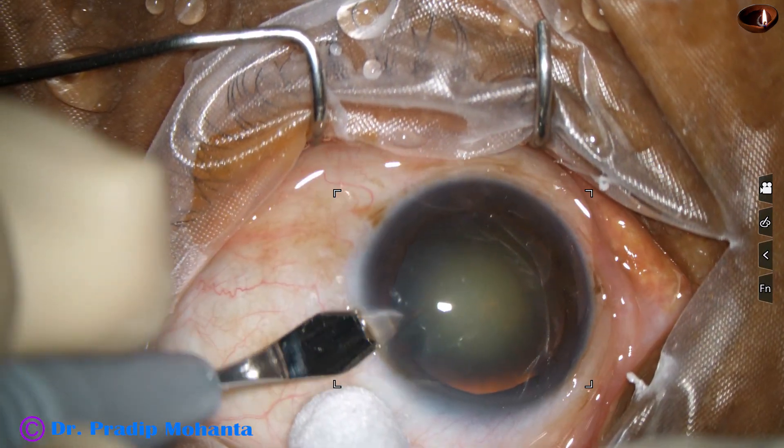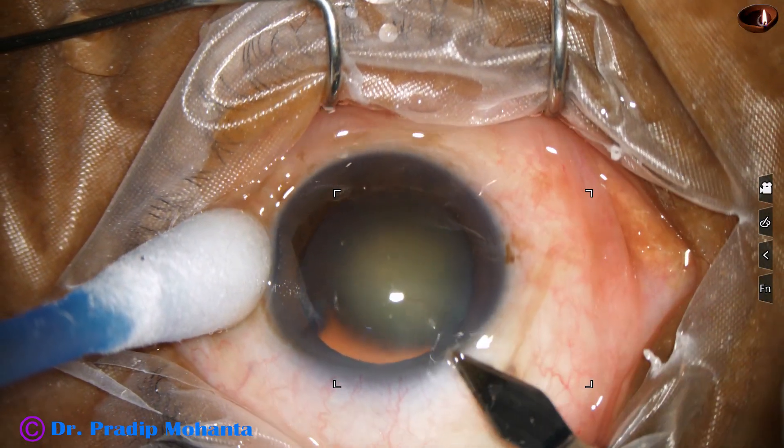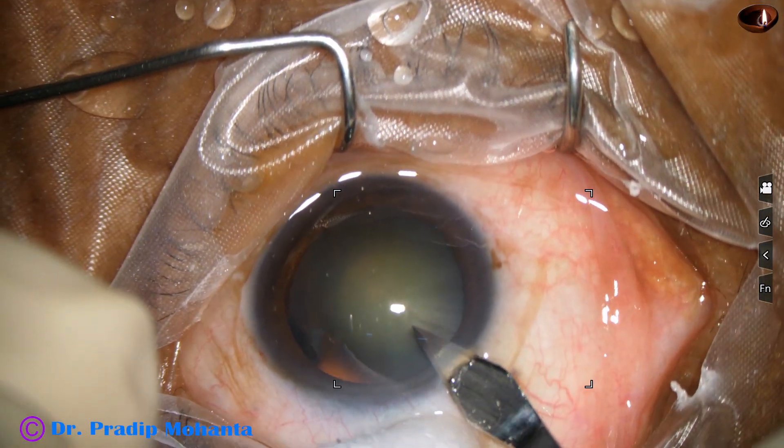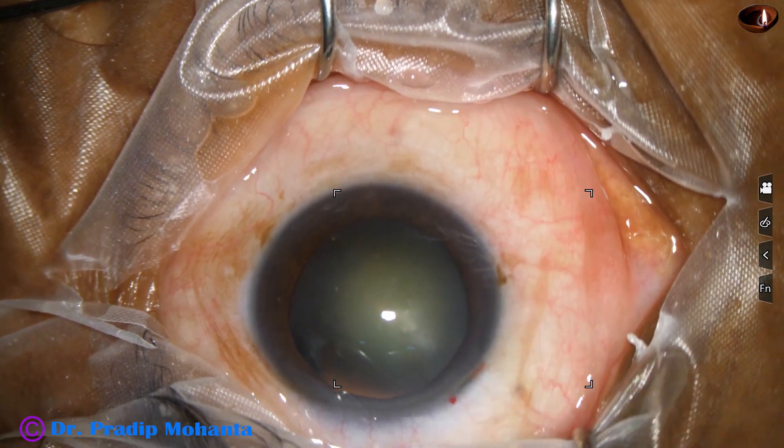This is a side port at 2 o'clock and this is the main incision at around 11 o'clock with a 2.8 millimeter steel keratome.